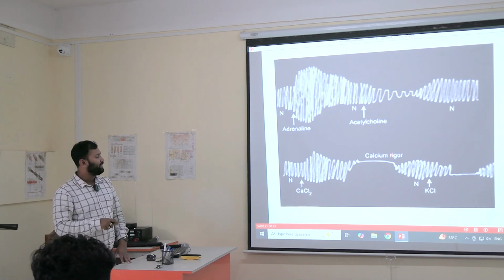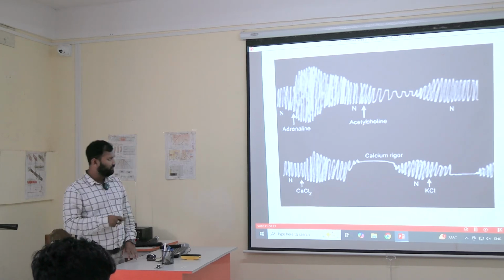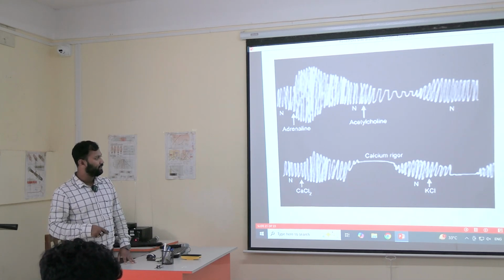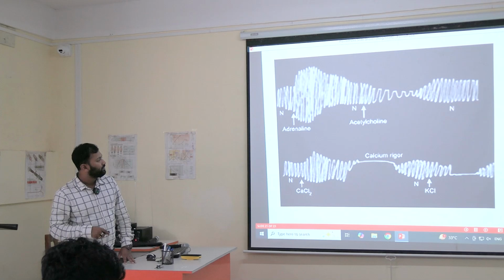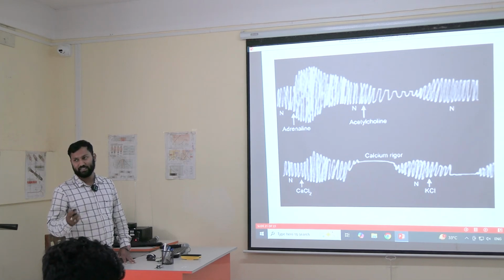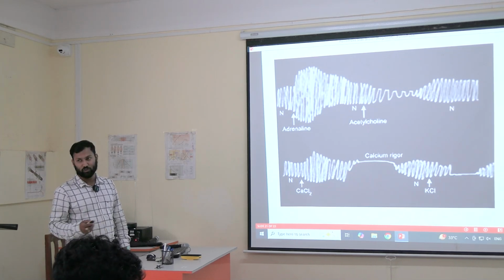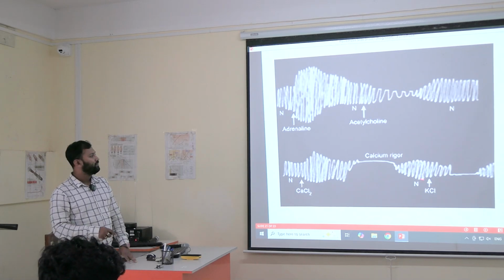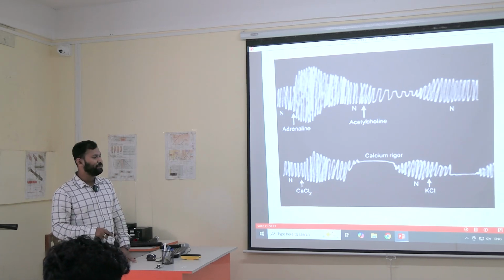A similar thing will happen in the heart, and the heart will be in a contracted state. That will be in a state of systole. The heart cannot relax. Then again we are putting potassium in the solution.